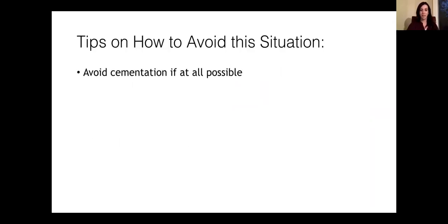So the first tip, it's a bit tongue-in-cheek, but basically avoid cementation if at all possible. So traditionally, when I started out with restoring implant crowns, my preferred method of restoration, which was the same way back then and it still holds today, is that whenever possible, I like to have screw-retained restorations. So if at all possible, I avoid cementation.